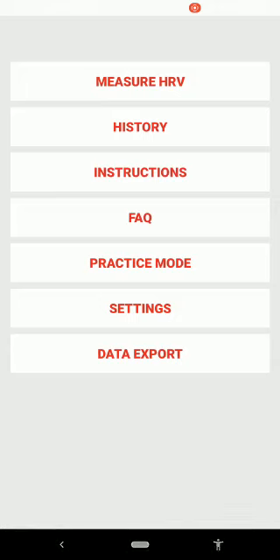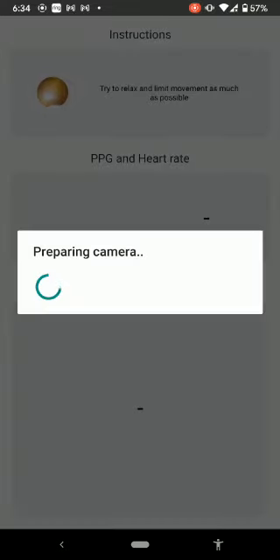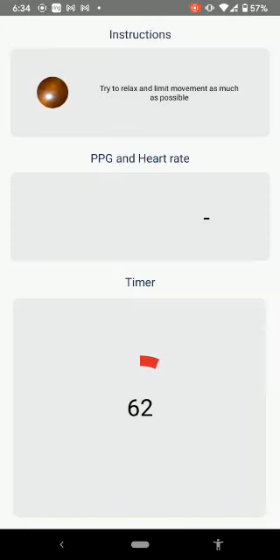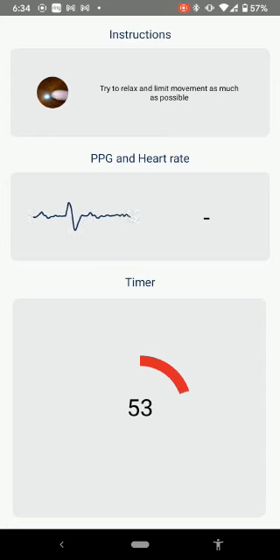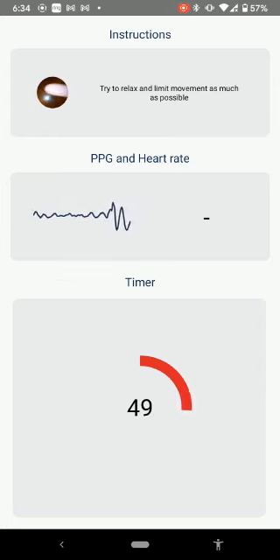To record a breathing session, click the first button in the menu that says 'Measure HRV.' It should immediately turn on your camera and flash. After the 'preparing camera' pop-up, the camera shows up at the top of your screen. Take your finger and place it right over the camera — this will help record your heart rate.